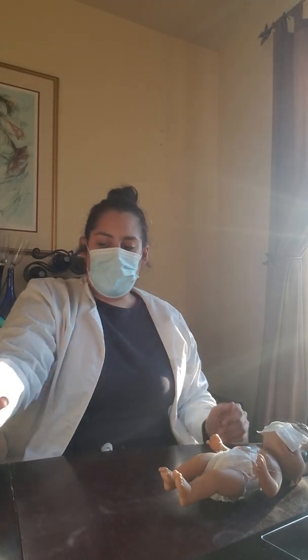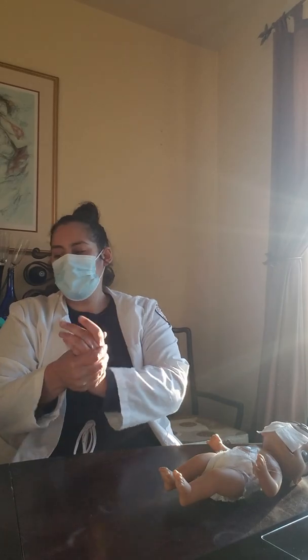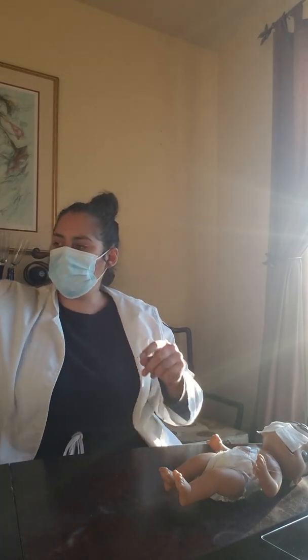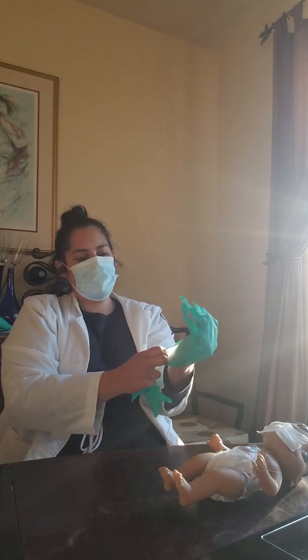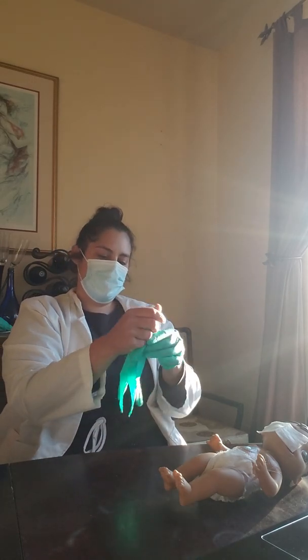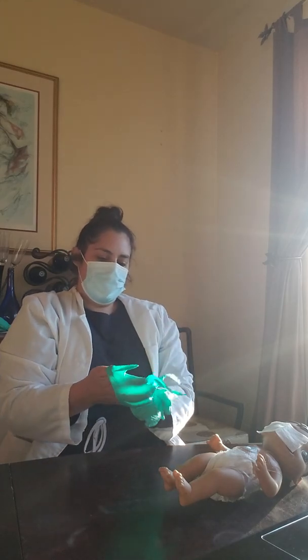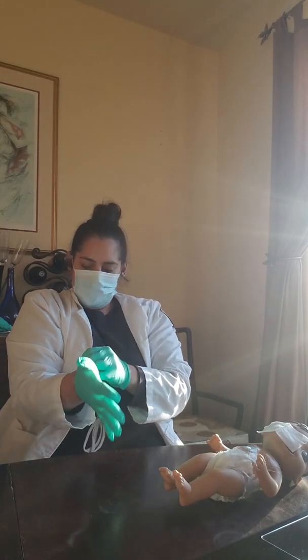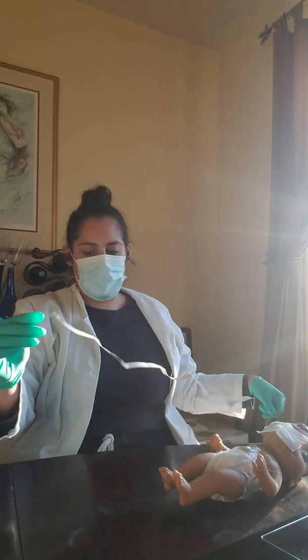And I'll back off, wash my hands, and put on some gloves. Don gloves. So the first thing I would like to do, because it's a see-through dressing, I'm going to go ahead and measure.